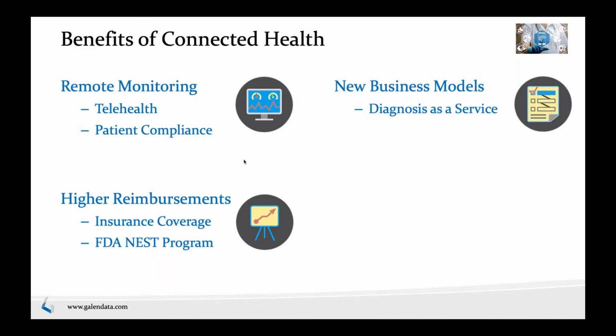In this case, you have diagnosis kits, specifically home diagnosis kits. A good example is some of the COVID at-home diagnosis kits that are going out. But essentially, instead of the traditional model where a patient comes into the lab, takes the sample, and runs a diagnosis that's done in the lab itself or in the doctor's office, you essentially move that collection to the patient's home.